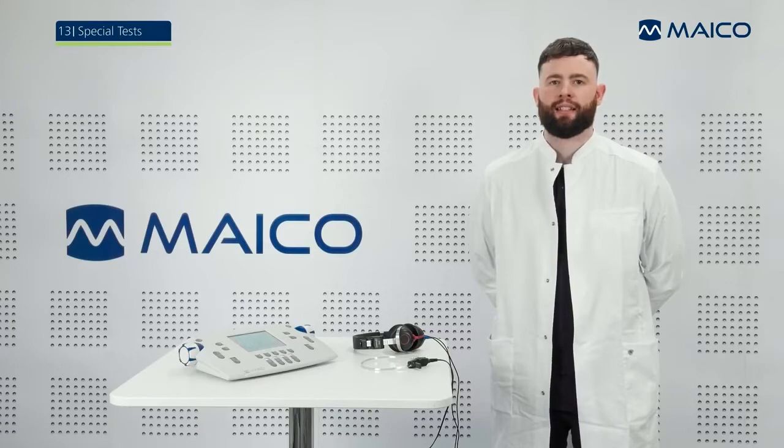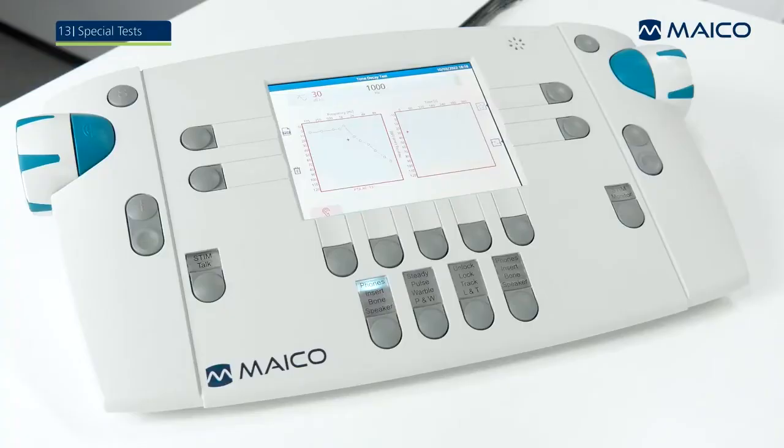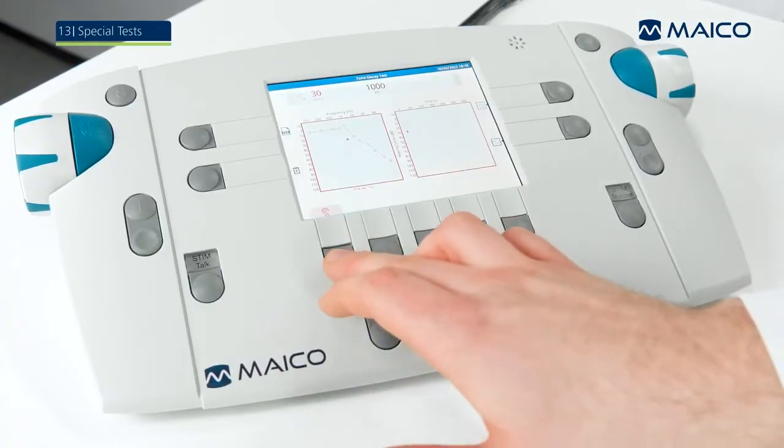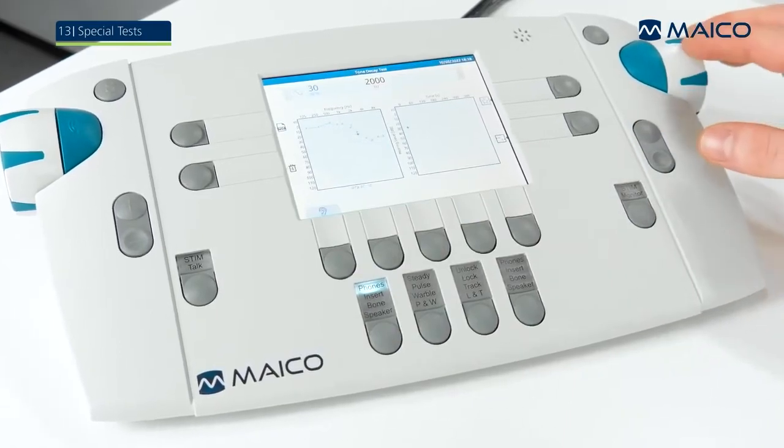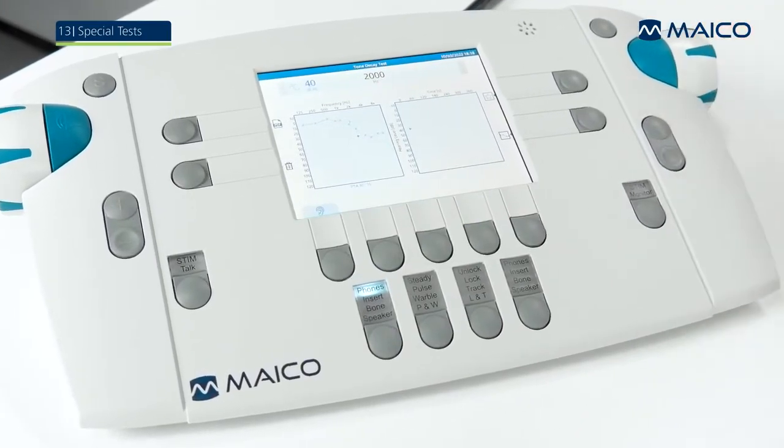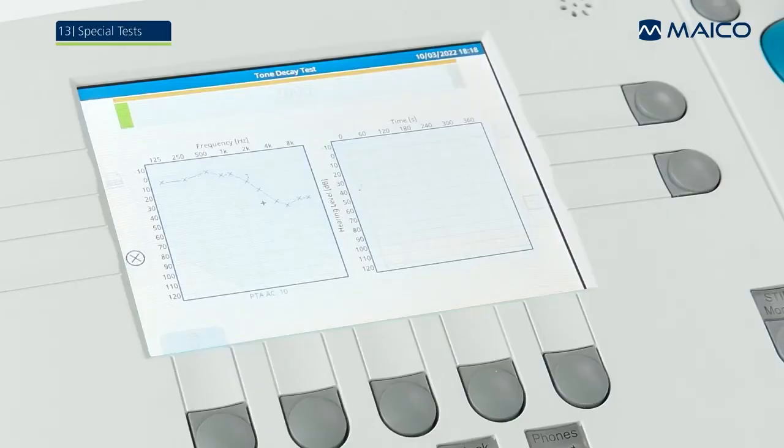The tone decay test is an automatic test that assesses auditory adaptation to a persistent pure tone. Set the ear side, frequency and level and press the stim button to start the measurement. Beforehand, instruct the patient to press the patient response switch as long as the tone is heard. When the patient releases the switch, the level is increased in 5 dB steps until the patient presses the switch again.